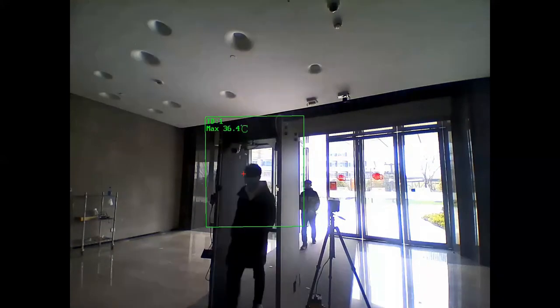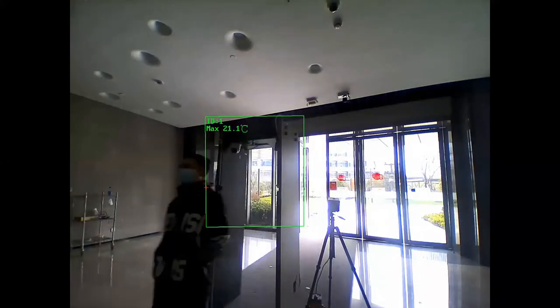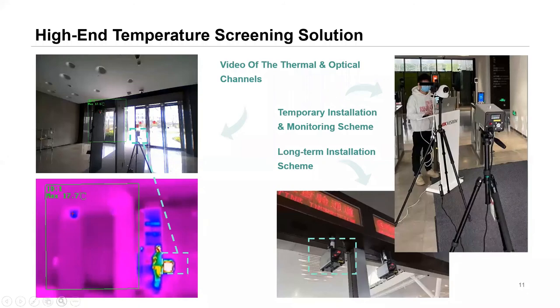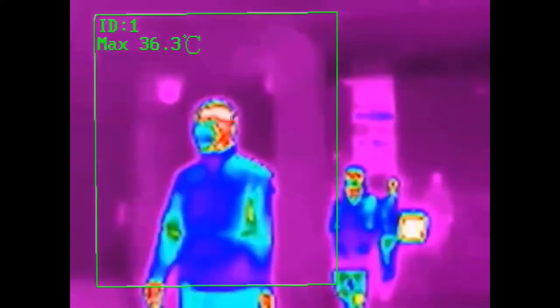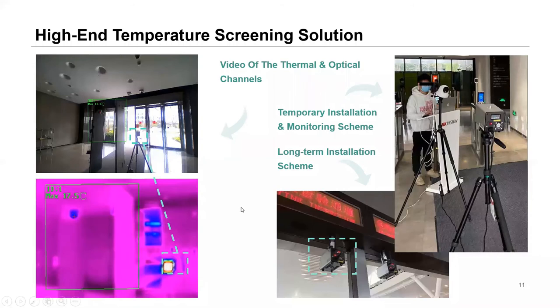As people walk through the detection area, their temperatures are being read. You can also see the thermal view. The camera can be wall-mounted or tripod-mounted, and the blackbody calibrator can be tripod-mounted, wall-mounted, or ceiling-mounted — though preferably it should not be higher than 1.7 meters.